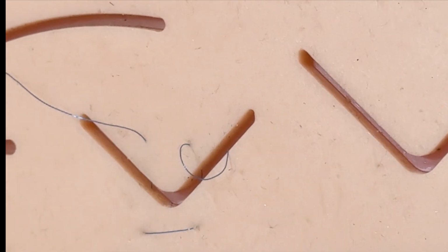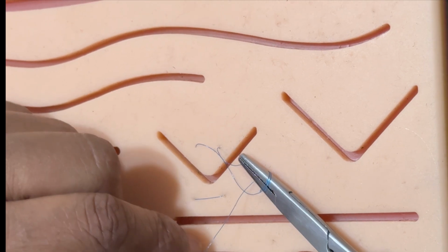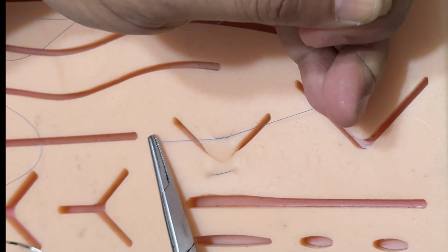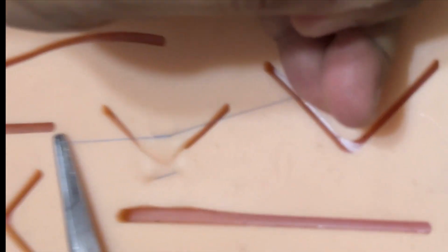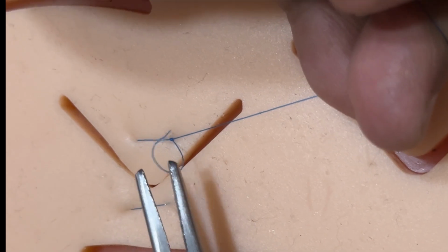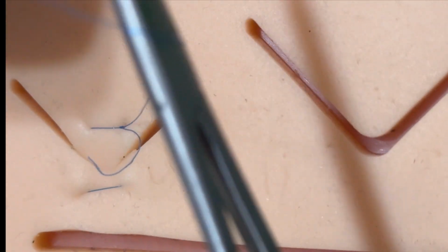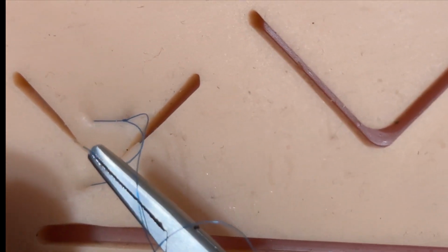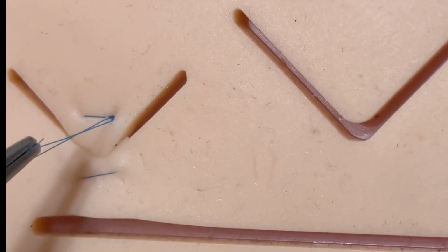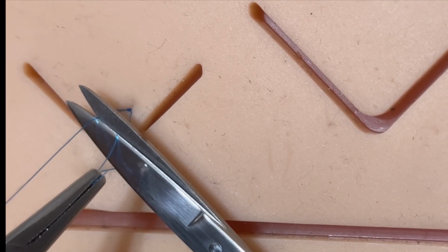Now after this we are going to tie the knot. Let's try to concentrate properly. Here again we'll be using the tip to tip technique, and look here, now I have approximated. Can you see? Look here, even these angles, this area is also closed. Now look properly, okay? Now let me go anti-clockwise. So this is the horizontal mattress in the angular wound, or you can say mattress suture in the angular wound.